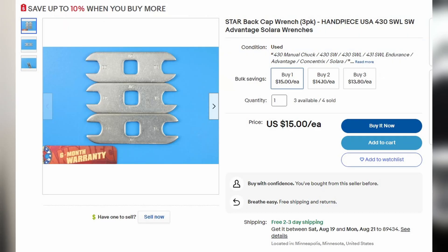You will also need a way to remove the back cap. I have a different version than the one shown here because it's not really available anymore. However, as long as you have something that works, that's all you need.